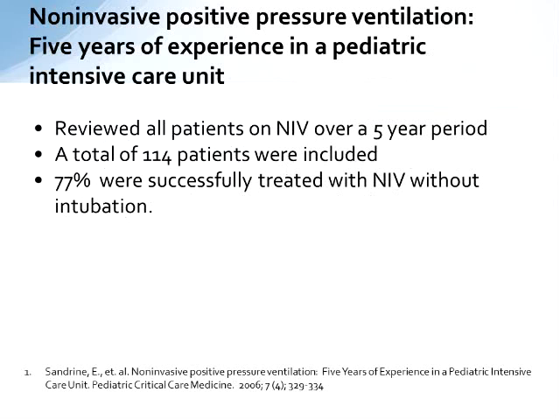This study was an observational retrospective study, but I think it's a good one that looks at the rate of intubation or the lack of intubation for patients that are treated with non-invasive ventilation. So this is a 5-year study in a pediatric intensive care unit, again published in Pediatric Critical Care Medicine. This is from 2006. So it looked at all patients in a 5-year period. Over 100 of those folks were included, with more than 3/4 of patients that received non-invasive ventilation able to successfully avoid invasive mechanical ventilation. So again, it seems to be working to avoid the dreaded ET tube.